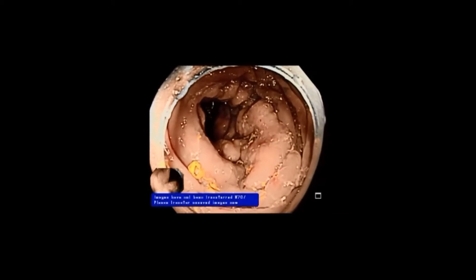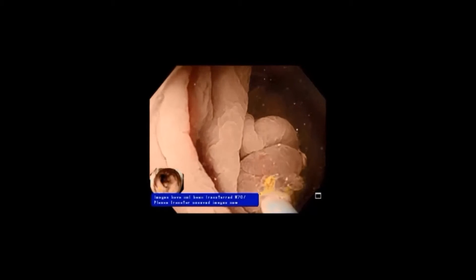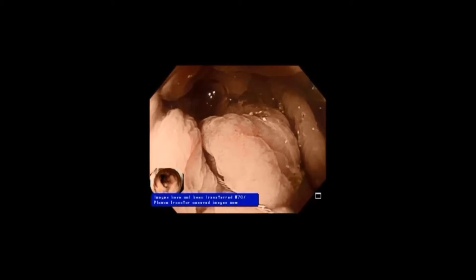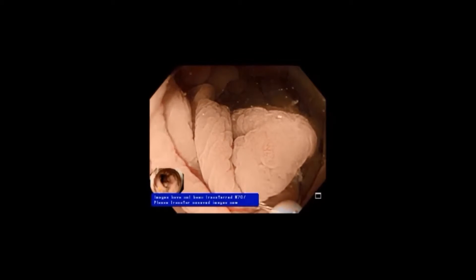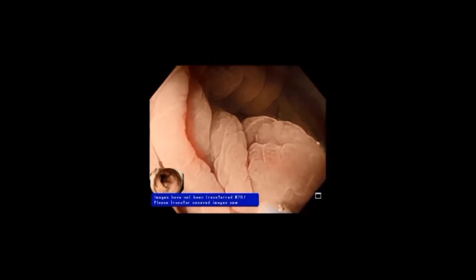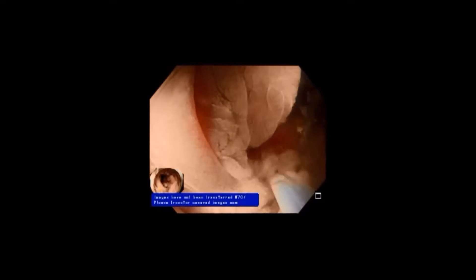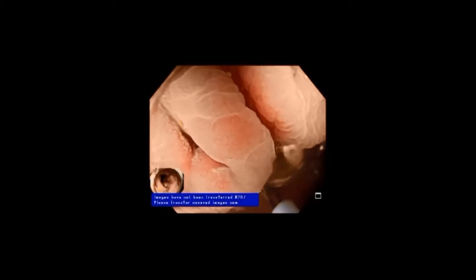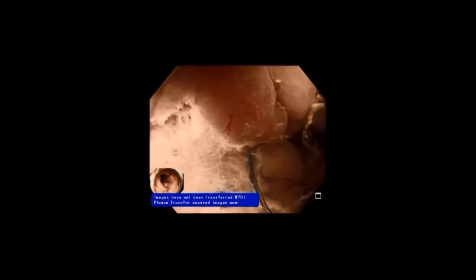Here's a very large lesion in the distal ascending colon and hepatic flexure. This lesion occupies about a quarter of the circumference over parts of it and extends over six to seven folds, so it's really a very large lesion. I just want to demonstrate that you can use this underwater approach even for very large lesions. So we're beginning our piecemeal EMR here without submucosal injection. This lesion is so large that we perhaps should have considered marking the perimeter on the normal mucosa two to three millimeters away from the edge of the lesion, and then we would use those marks by extending the resection out to include them to make sure we had a complete resection. But I found that during the procedure with a very high definition instrument I can actually track the edges of the lesion quite easily.